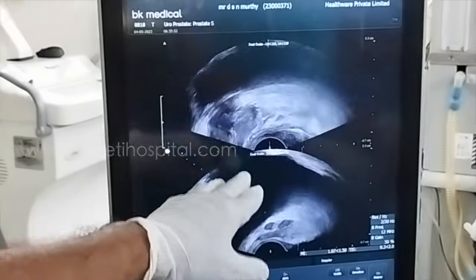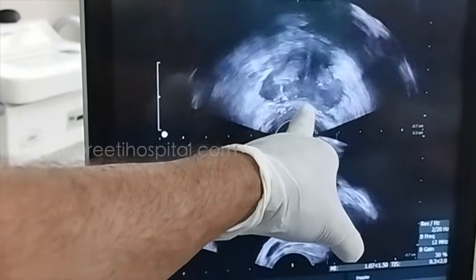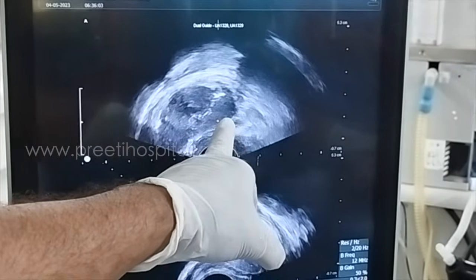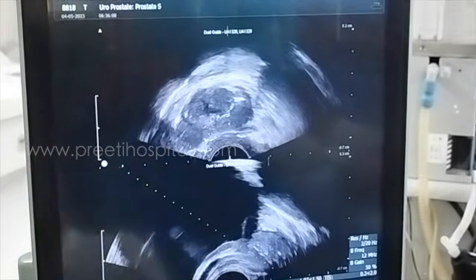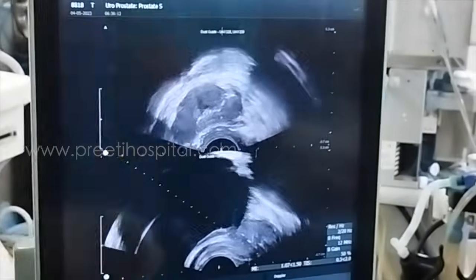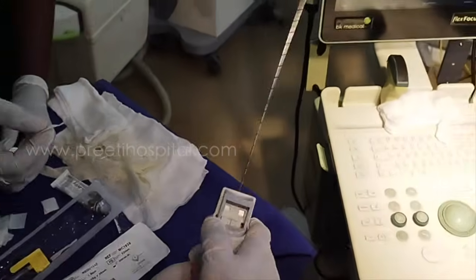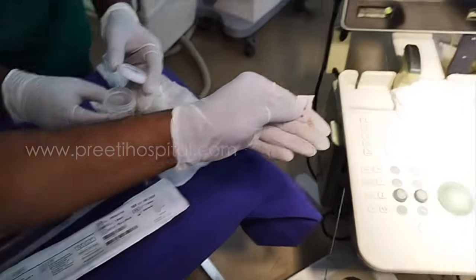Yes. One is again we'll show this center. Yes, the base. This is the base. Base on which side do you want to take now? Left, left lateral medial. First are you taking lateral or medial? Medial. Turn this side a little. Yes. Now left base medial peripheral zone sagittal. Fire. Yes. Left basal region median sagittal. Now a nice piece has come.